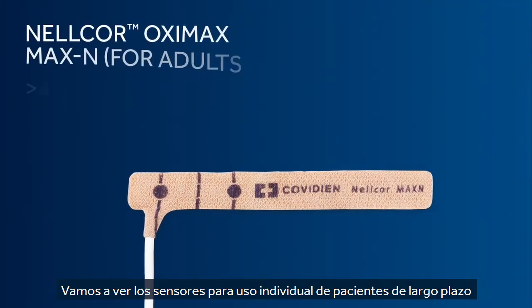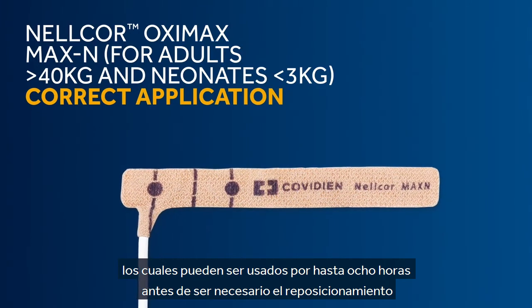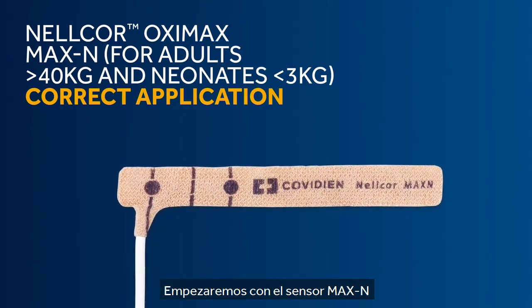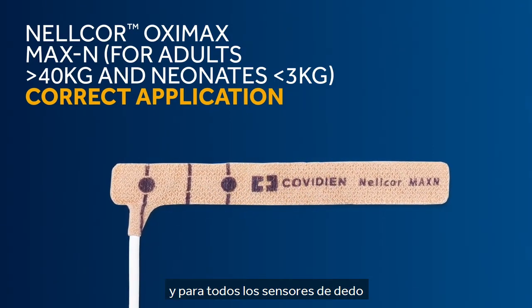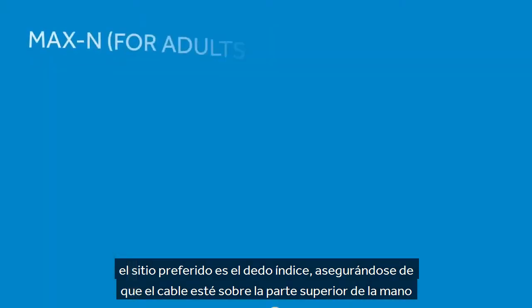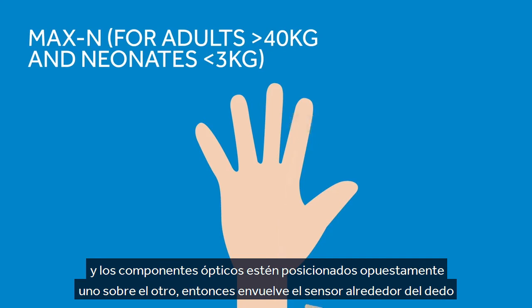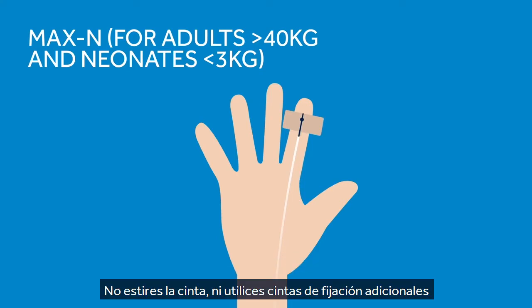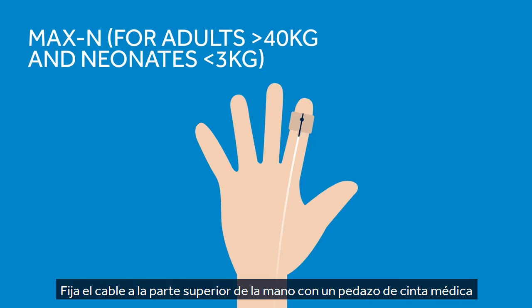Let's take a look at the long-term, single patient use sensors, which can be used for up to 8 hours before needing to be resited, starting with the Max N sensor. To correctly apply the Max N for adults over 40 kilograms, as with all the finger sensors, the preferred site is an index finger. By ensuring that the cable is at the top of the hand and the optical components are directly opposite one another, wrap the sensor around the site. Do not stretch the tape and do not attach any additional tape, as this may cause venous pulsation. Anchor the cable to the top of the hand with a piece of medical-grade tape if required.